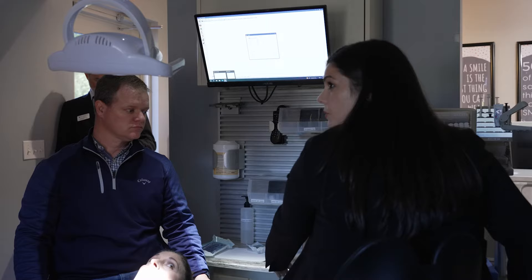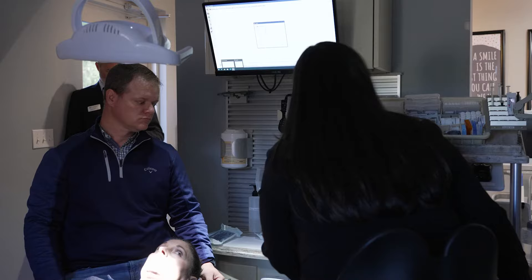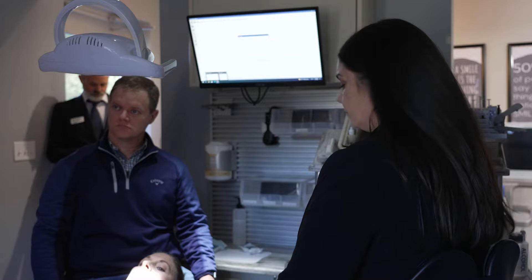You're going to use the left side here to line up with the patient's left shoulder. That's where the marker is for the assistant, but they do get flexibility if they want it farther or pushed a little bit out of the way as well. Align to the patient's left shoulder — the Corian piece, right here.